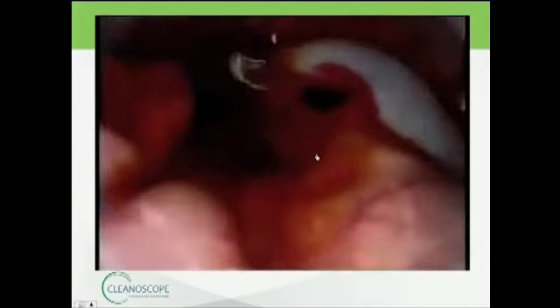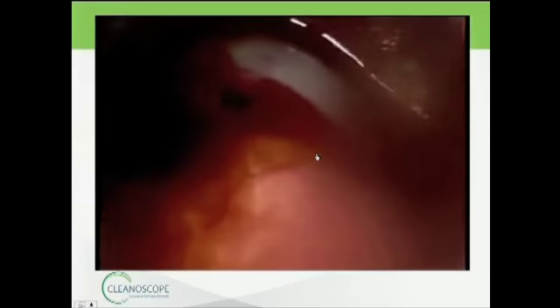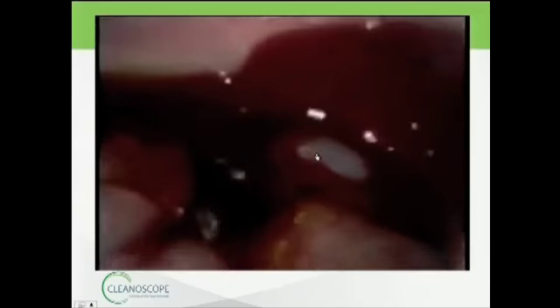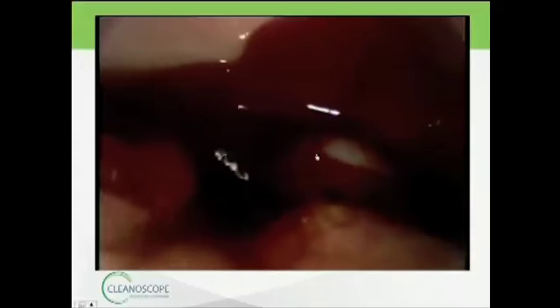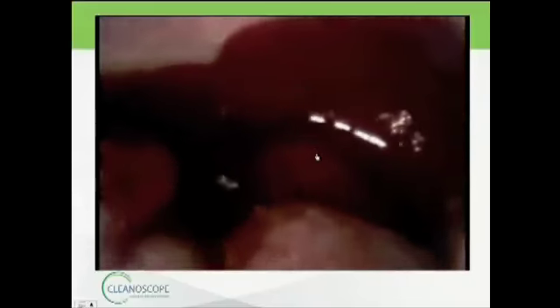Next slide. Can you advance the next slide for me, please? Thank you. Okay, so this is pig gallbladder, and you're putting it in there to purposely make a smudge on it. So it's smudged, and then you see it clears. They push the button so it's clear, and they'll do it again. They stick it right in the middle of blood and bile, and you'll see a smudge on the end of it. There must be a laser pointer. Oh, here it is. You'll see. And then they hit the switch. Right now there's a switch. There won't be a switch on it. Smudge. Clear. So once they turn the disc on, it totally clears it.